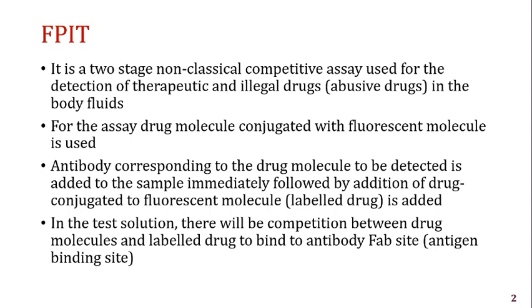The antibody will recognize the drug molecules and form a complex with the drug molecule through the FAB site. If the FAB site of the antibody molecules are engaged by the suspicious drug, then fluorescent molecule complex drug molecule will not have any chance to bind to the antibody.